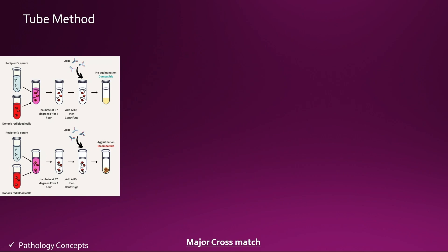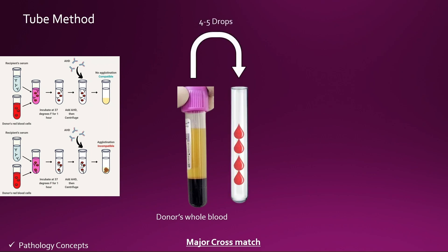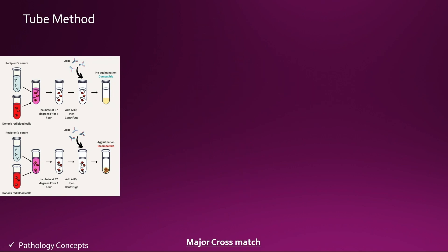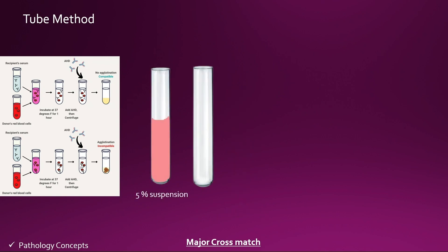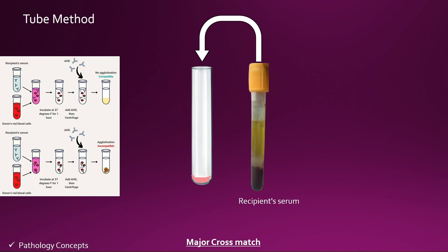Now let's learn the tube method of major cross match. First, take the donor whole blood and add 4 to 5 drops of donor whole blood into a new test tube and add normal saline to prepare a 5% suspension of donor whole blood. From this 5% suspension, add one drop of RBCs into a new test tube.